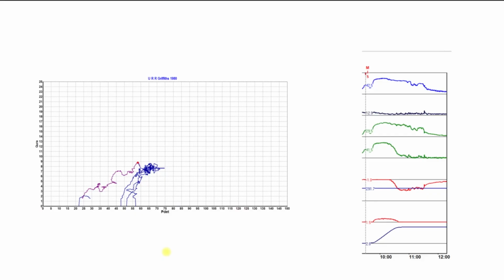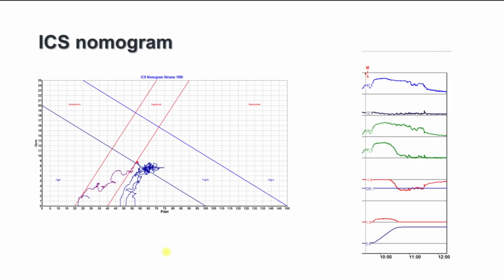Now, if we were to analyze this point in a graph, we would go for the ICS nomogram, which represents both situations, that is detrusor contractility as well as the presence of obstruction, in one single graph. We'll see how. This P det Qmax point is here as a red dot. We can see these vertical lines from left to right.